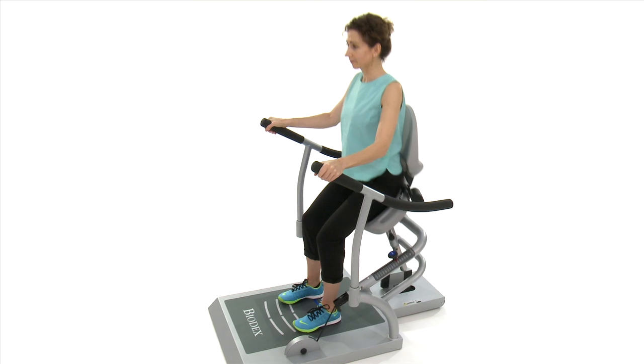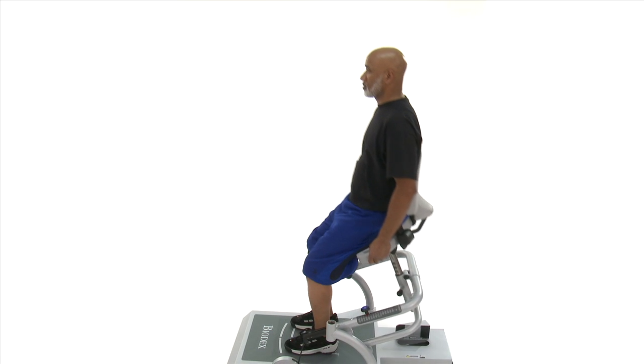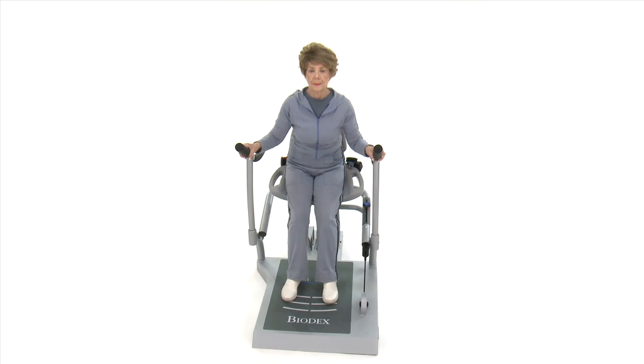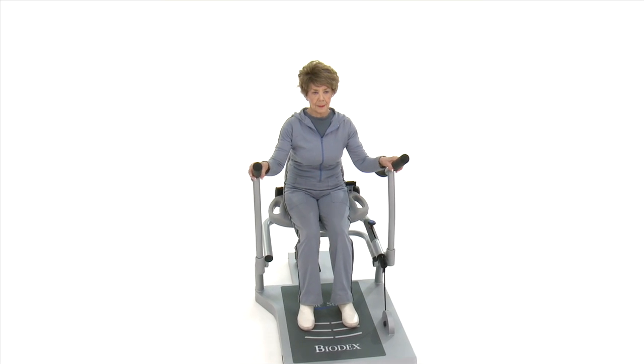This easy-to-use device is suitable for a broad range of populations, from active baby boomers to the elderly intent on avoiding dependency, to those compromised by sarcopenia, disease, or injury.